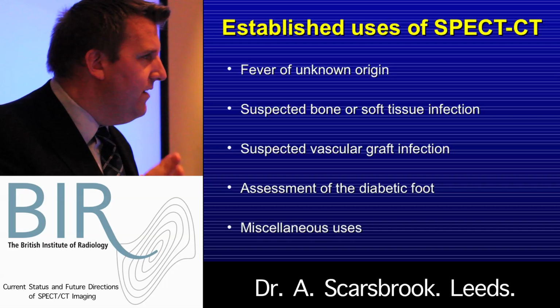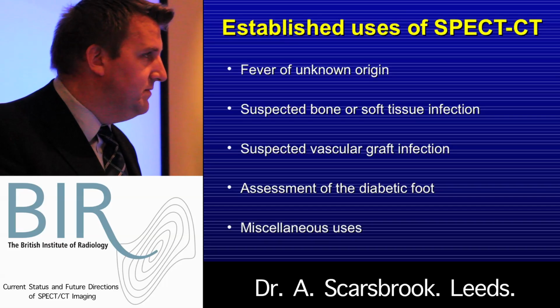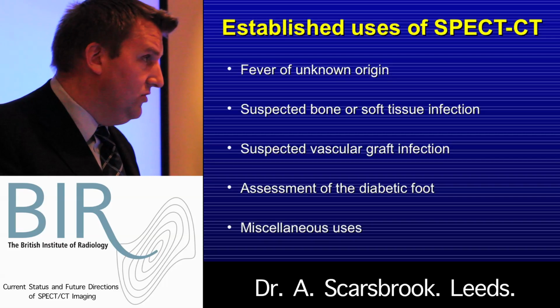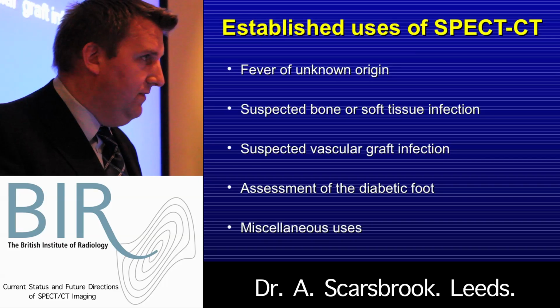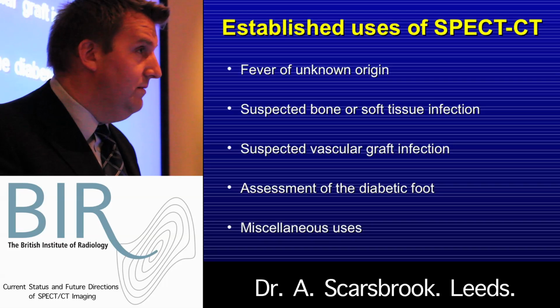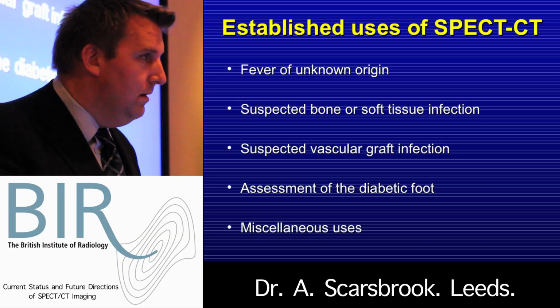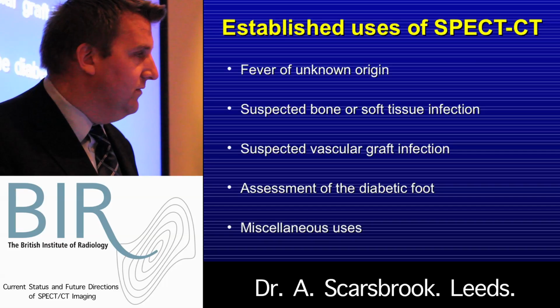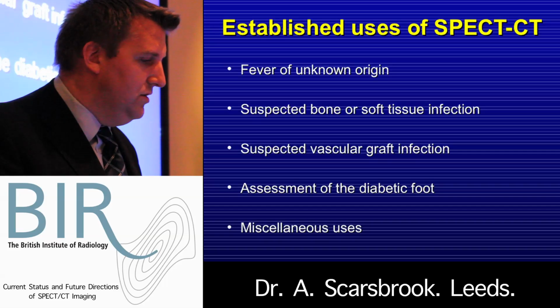So the 5 areas I'm going to cover really are the use of SPECT-CT in patients with fever of unknown origin, suspected bone or soft tissue infection, suspected vascular graft infection, assessment of the diabetic foot, which we haven't heard about today. I thought we might have done, so I won't be boring you with the same things, and then just to finally finish off some late-breaking applications.